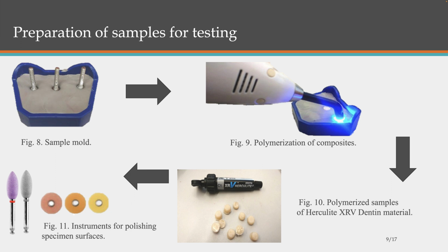The mold used to create the specimens was made of Z+ condensation silicone elastomer, which is used as the first layer of a two-layer impression in dental prosthodontics. Z+ is a material with increased hardness and resistance to deformation, and increased initial elasticity for increased fluidity and dimensional stability. The material was kneaded in the hands for about 30 seconds until a uniform color was obtained.